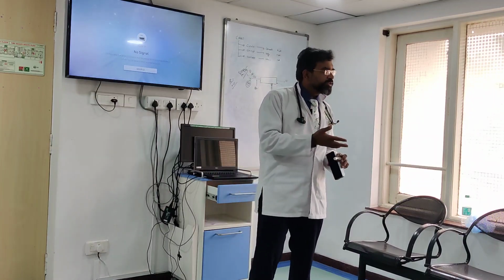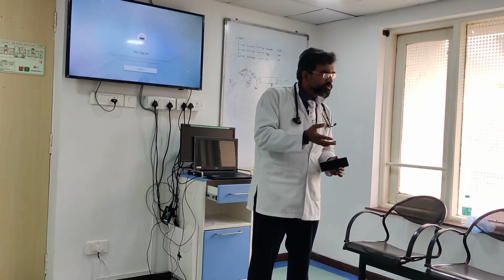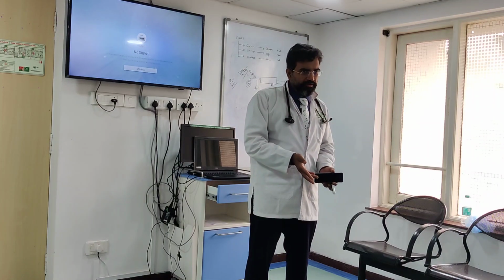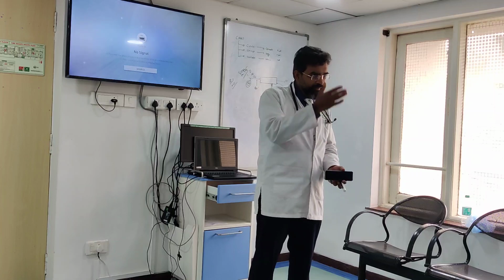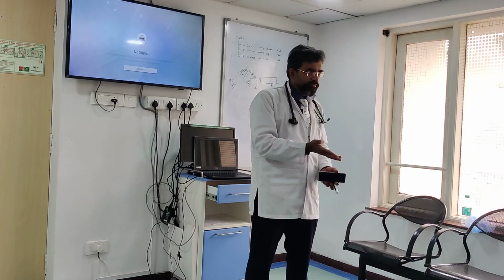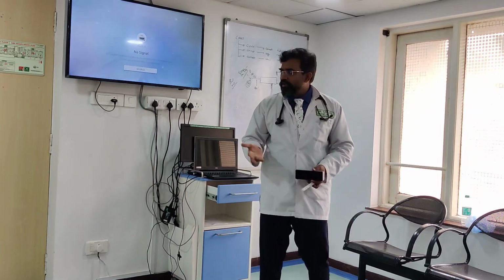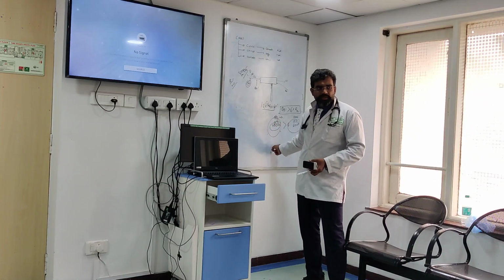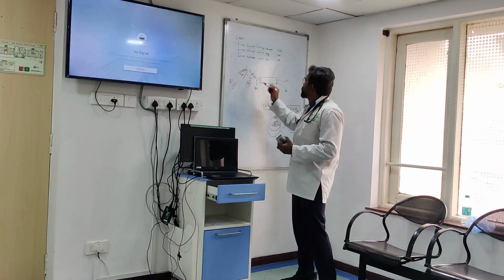Right? Because if the filter clots, pore size gone, no pores, no diffusion, no convection, efficiency will fall. Are you understanding? That filter has to be maintained. That is the entire problem. Okay? And that is why I will want to keep it at this situation. Clear? Now what happens in this modality?